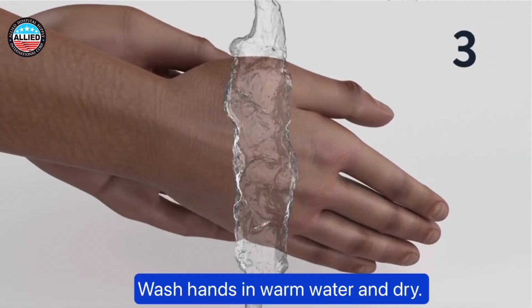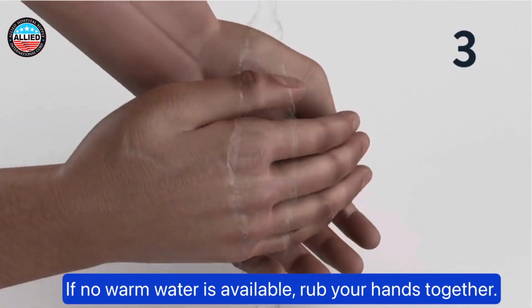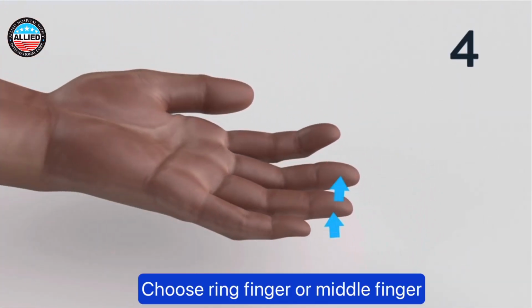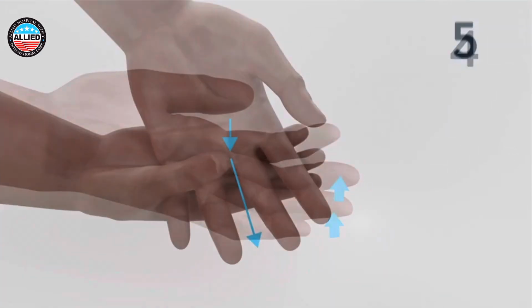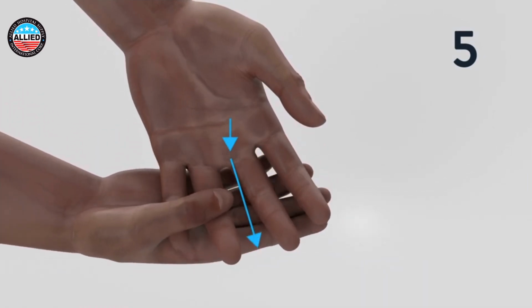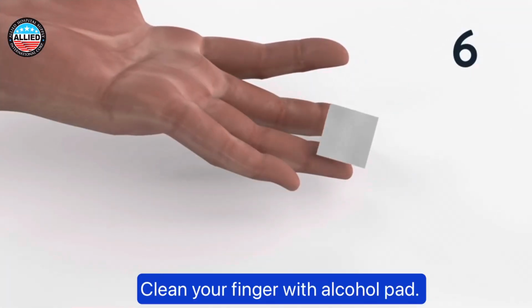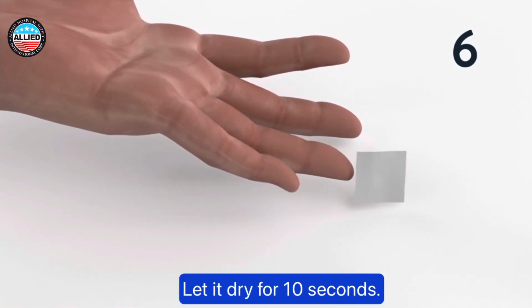Wash hands in warm water and dry. If no warm water is available, rub your hands together. Choose ring finger or middle finger. Massage and rub your hand finger to increase circulation. Clean your finger with alcohol pad. Let it dry for 10 seconds.